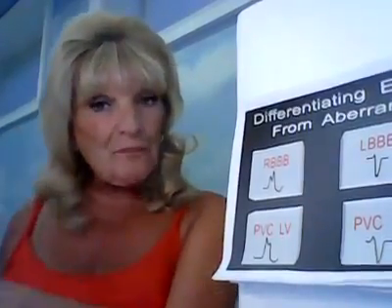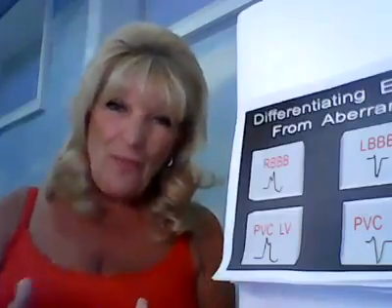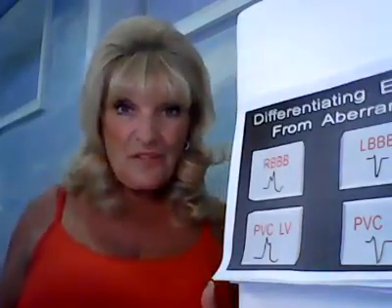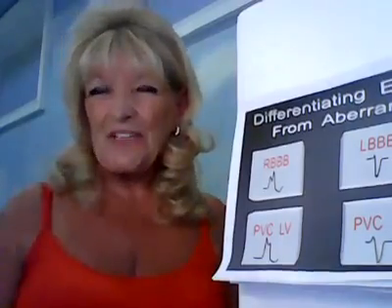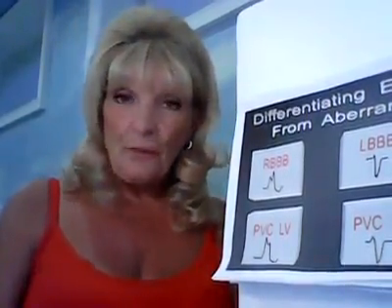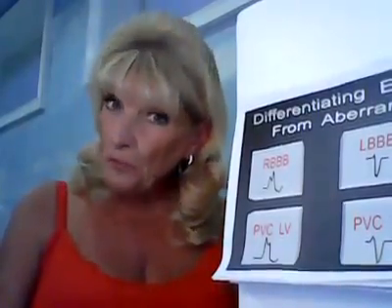So if I have a cardiac patient and there's no beds available except in the trauma room, we put the cardiac patient in the trauma room, but there's only a 3-sticky system. So it's very important for me to monitor him in V1 or MCL1, but I can't. So I put him in what's called a Lewis lead, which gives you the same configuration as a V1 or an MCL1 lead.